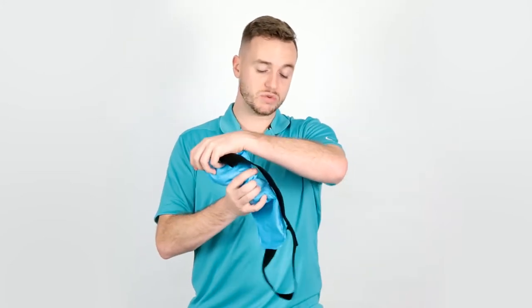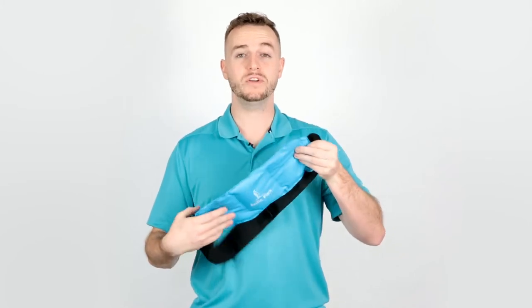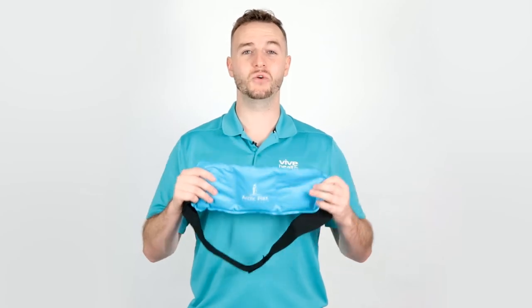It comes with this strap, so it allows you to safely secure the ice pack in place so that the ice pack's not going to move, or you can actually move around with the ice pack on. And this is the Arctic Flex Hot and Cold Wrap.